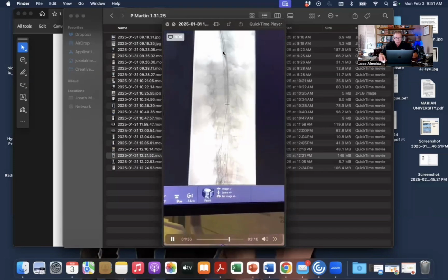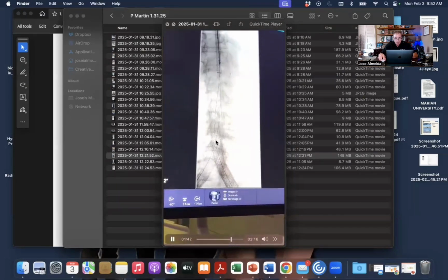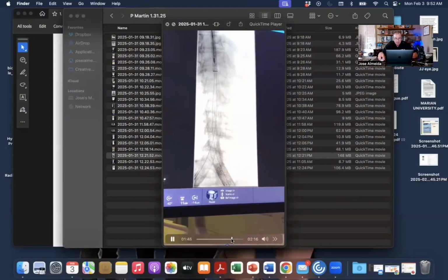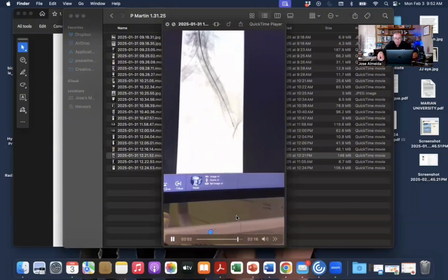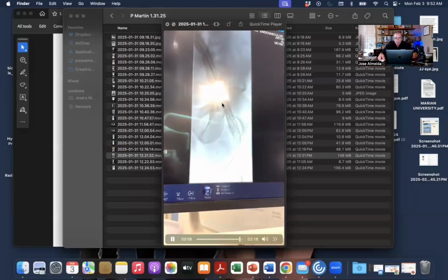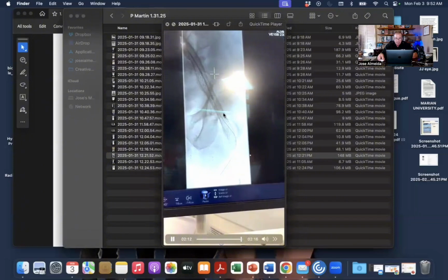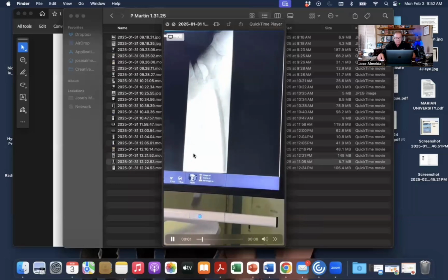Here you see the Rev Core coming down, and it's on the wire to the left-sided stent. Here you see the Rev Core coming down the occluded stent over the wire that we had placed. Again, the wire enters here, so I wanted to hopefully get this thing down in here, get a new tract, and from below the wire up and connect the dots. That's what we were trying to do, but we were having a hard time.